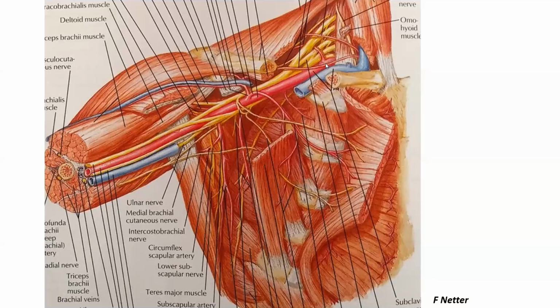This is unlike the subclavian artery, and that's another advantage of the axillary artery. The subclavian artery is posterior to the vein, and in order to access it, you have to go through the vein. Whereas the axillary artery is set apart from the vein. It is deeper, but it becomes as superficial around the mid and distal segments, particularly when you open up the arm. So you can stick it separately from the vein. You don't have to go through the vein, which of course you don't want to do.